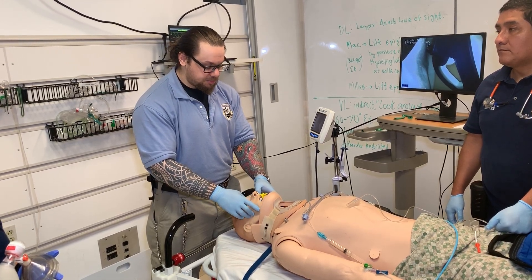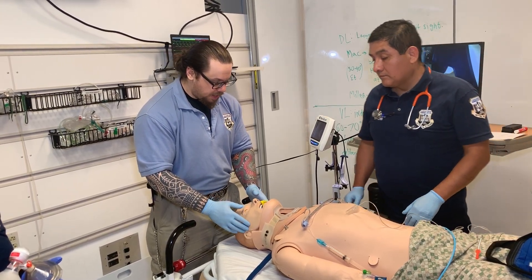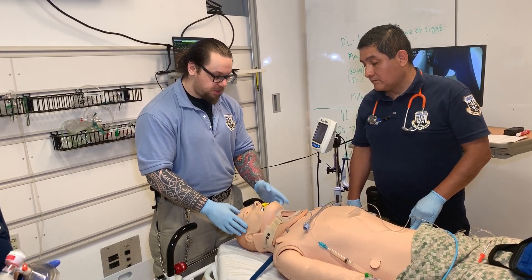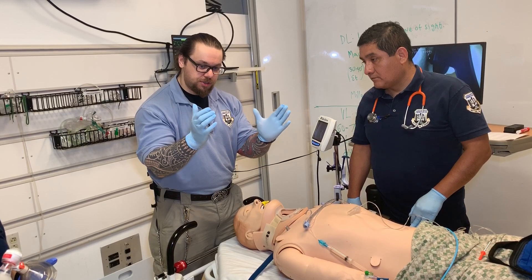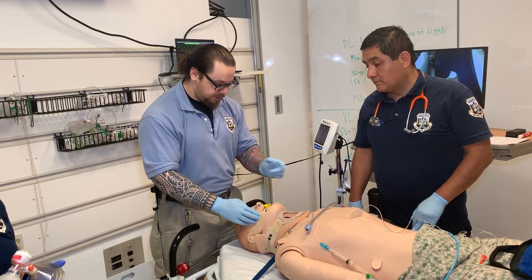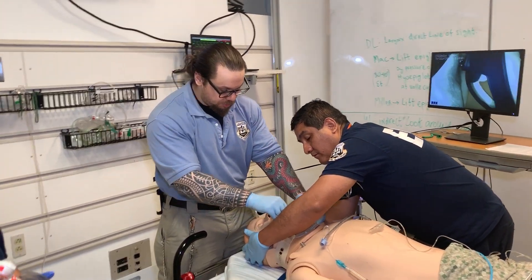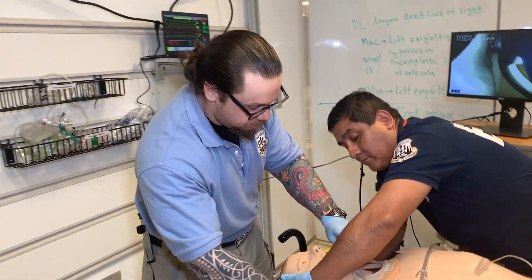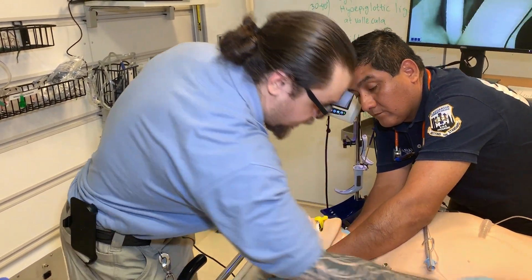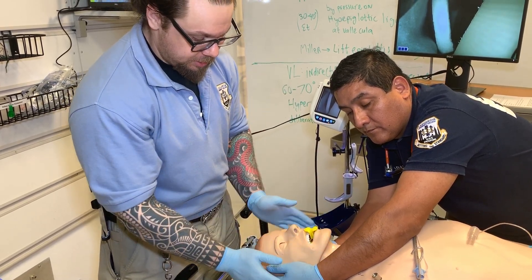But we cannot do so unless my partner regains C-spine stabilization. I'm going to have him perform a MILS technique — manual inline stabilization. He's going to take an ear muff approach, putting his hands on the ears and not on the mandible so it's freely movable. Now I'm going to remove the front portion of the cervical collar. Once it's off, you can see the mandible is able to be moved and he's maintaining the ear muff approach.